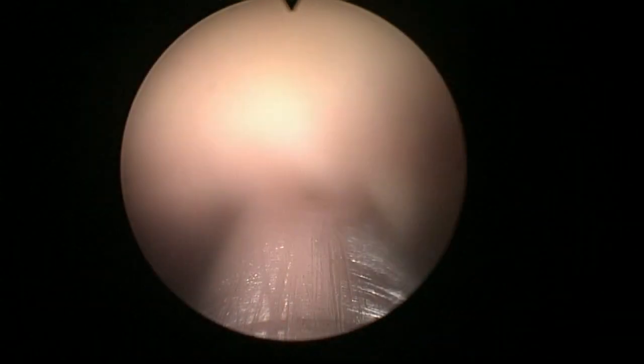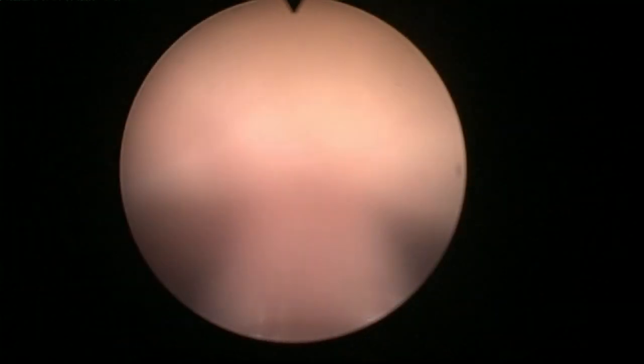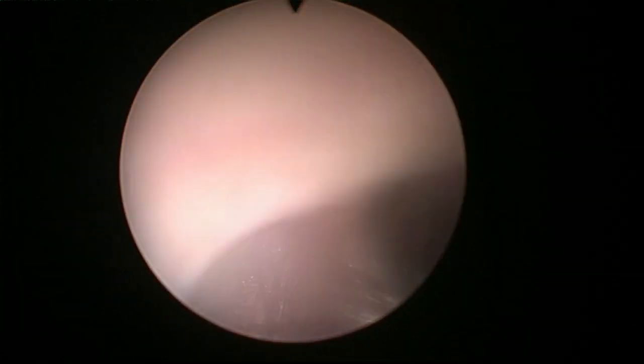distending the bladder for more than 20 minutes is going to cause bleeding from the fossa that gets distended again, bleeding from the bladder, from the mucosal edges, and also because we don't have a continuous flow system. We have entrance of water, and there's some outflow, but it's not an efficient washout. So more and more the visibility is going to degrade.